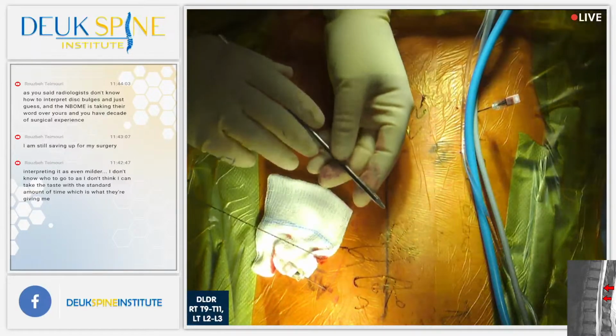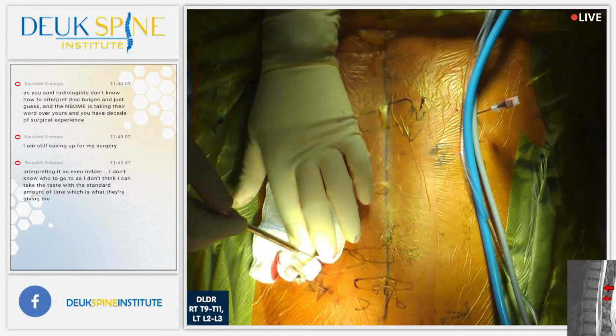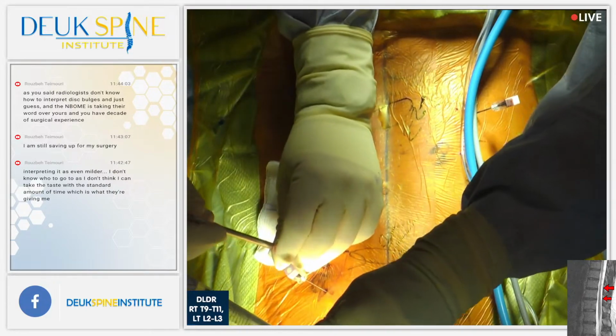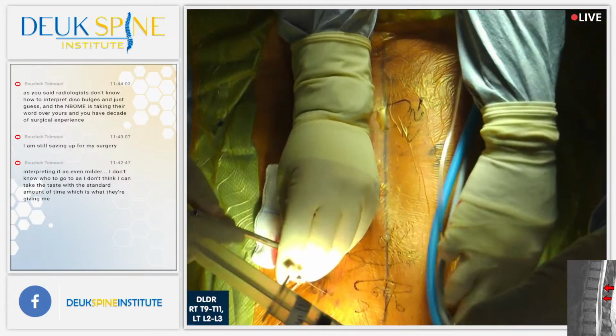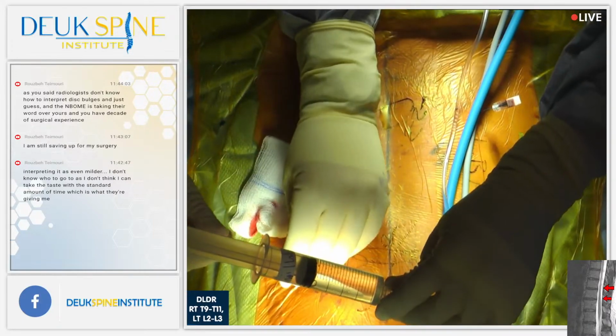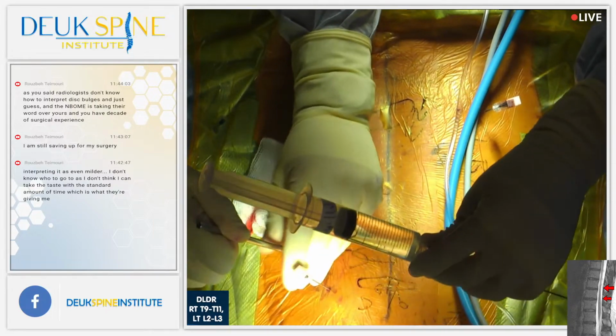Now, next step is dilator. It spreads the tissues. If you understand what I'm doing here, you'll understand why this is the only and best surgery in the world for you if you have a thoracic disc problem. We are spreading the tissues at this point. We are not cutting anything. We've already cut the skin. That's all we're going to cut this whole surgery. Shot?